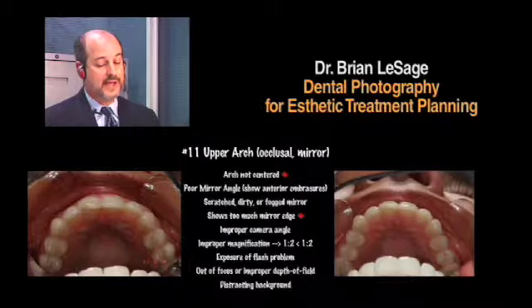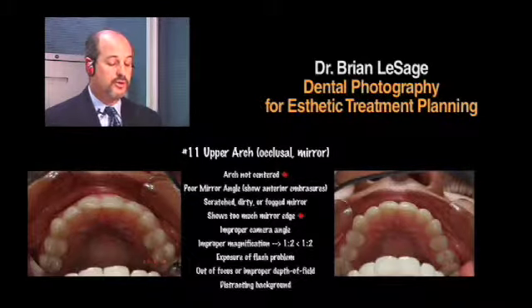There's a couple other options you have to prevent fogged mirrors. One, you can put the mirror in a hot water bath. Some people also use hot heating pads that get the mirrors basically to room temperature, or body temperature, I should say, and then they won't fog. So those are other ways that you can prevent the mirrors from fogging and be able to do these views by yourself.